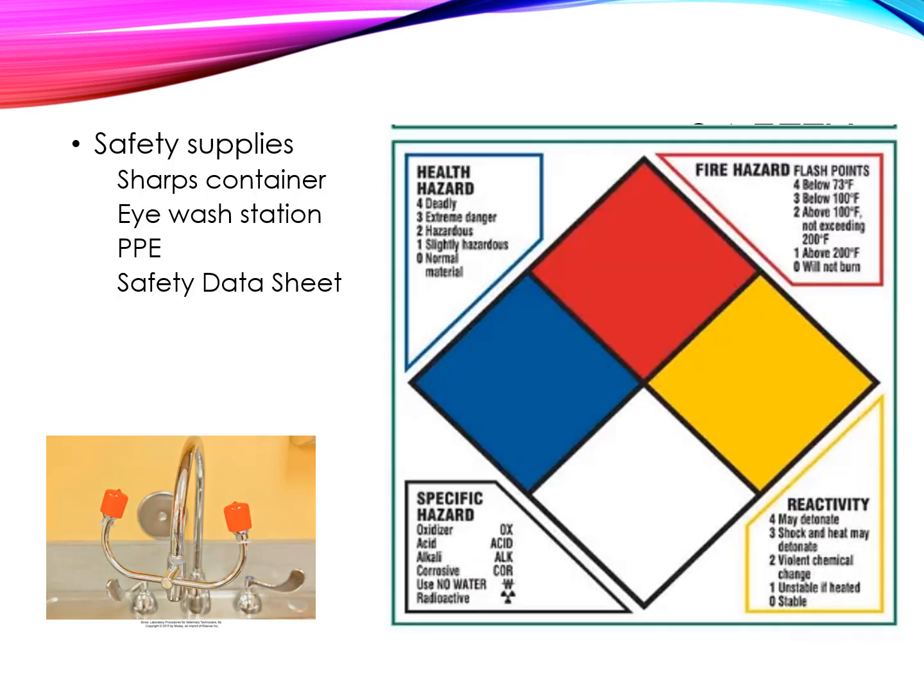So in the laboratory or in the animal hospital, we do need to be aware of the safety issues and also our PPE, or protective equipment. All hospitals should have sharp containers for your needles and catheters and slides. Depending on the hospital, some do put certain things in there and some don't, or they like to separate them into separate sharp containers.